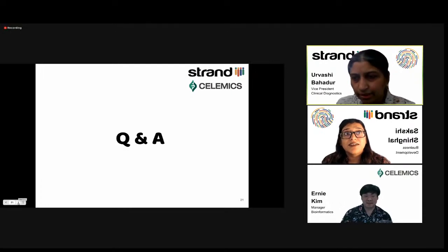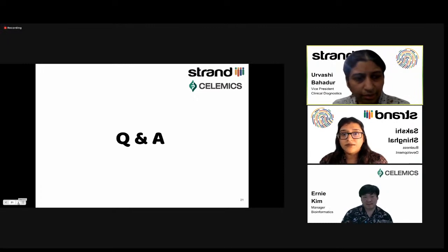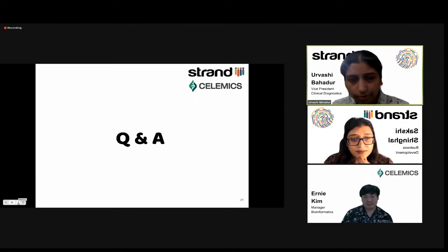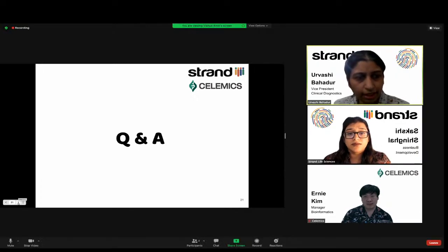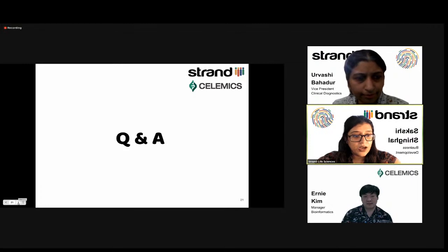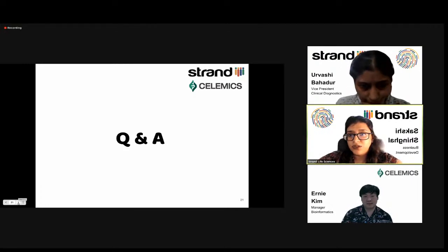Yeah, if the question can be explained a little bit more, but I'll answer what I think. We annotate the variants with data that we've generated and got from literature and multiple things like that. Maybe the question can be elaborated a bit, then you can answer it. Okay, so we can wait for her to say that. While we wait for her, maybe Violetta, if you could clarify your question a bit, that would be great.